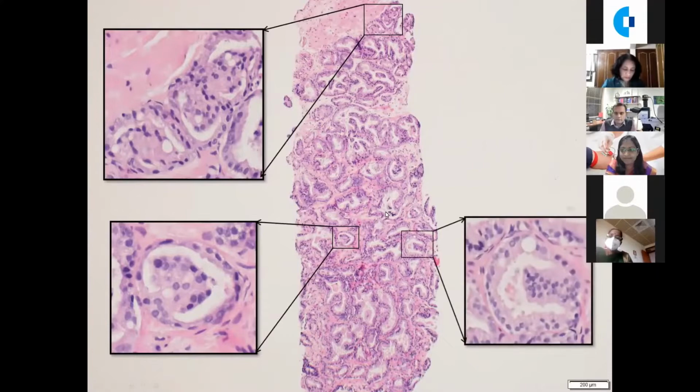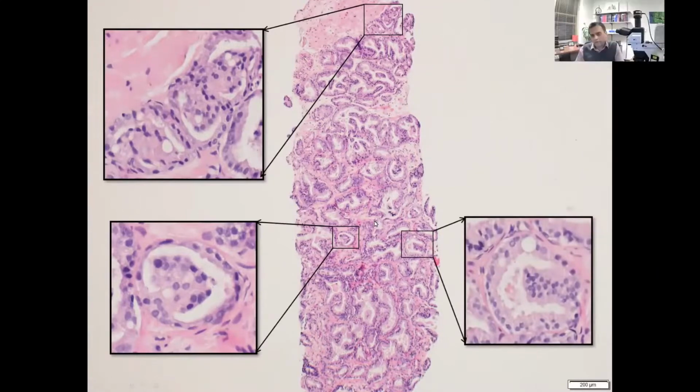The caveat here is to be careful with what we call glomerular formation, because we have started calling even very small ones Gleason pattern 4. So in this example, I would not call this a glomeruloid formation, because many glands in Gleason pattern 3 can actually be large and convoluted. For example, you see a malignant gland here which is large and convoluted.